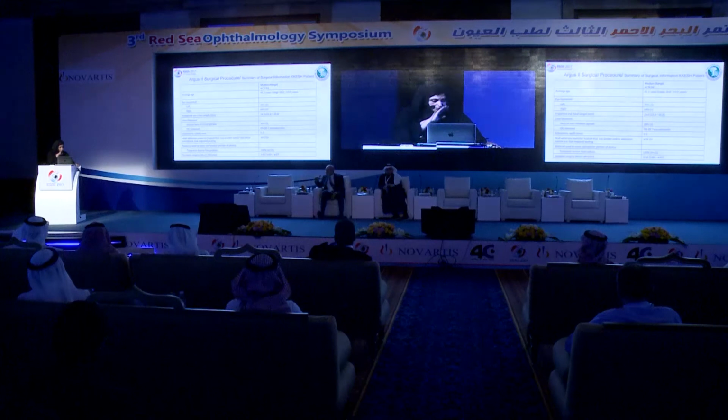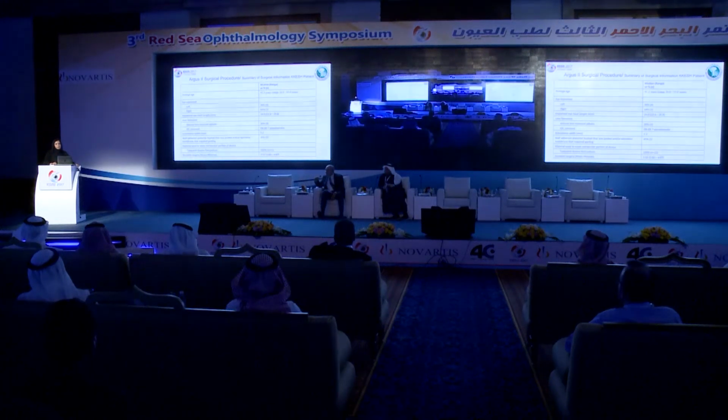This is the summary of our patients with an average age of 41, range 26 to 55. Four left eyes implanted, 7 right eyes implanted, and the axial length is on average 24. We did 3 lens aspiration or phaco, and we left the patients aphakic, and 7 patients were already pseudophakic. We did posterior capsulectomy for them if needed. You should do posterior capsulectomy if it's not there.